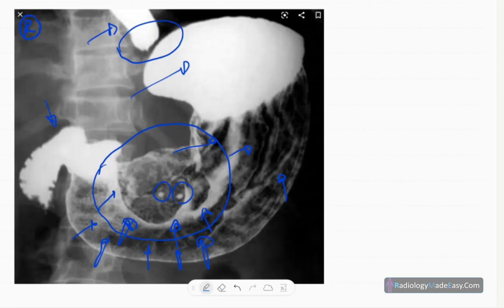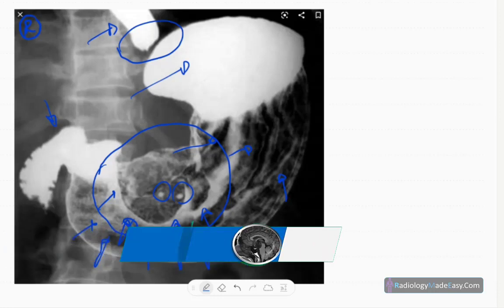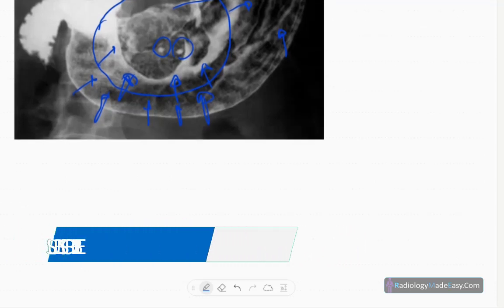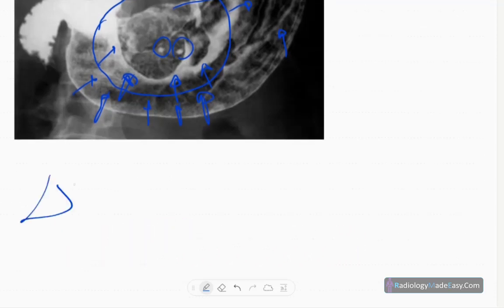So it's a mass lesion in the lesser curvature of the stomach. The diagnosis is gastric lymphoma.